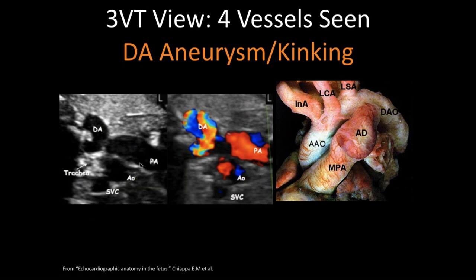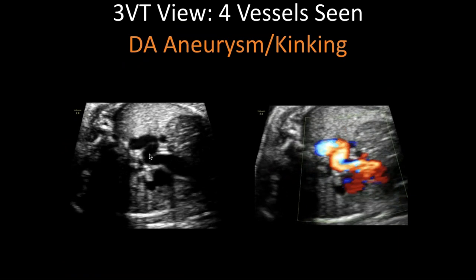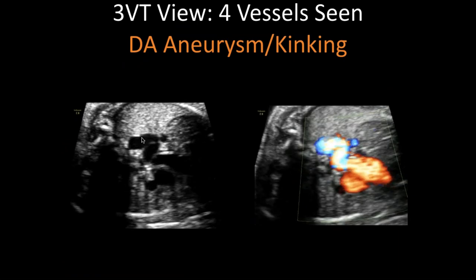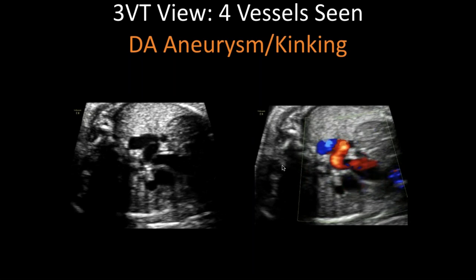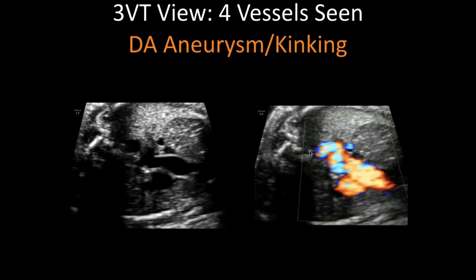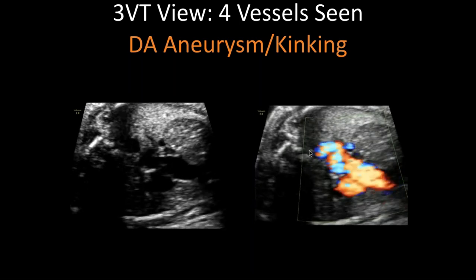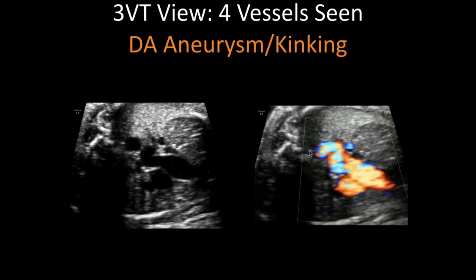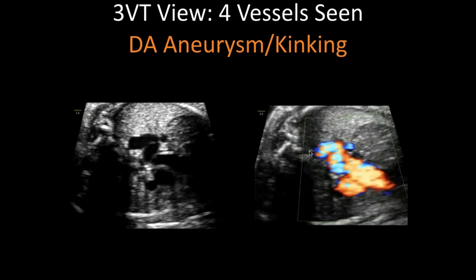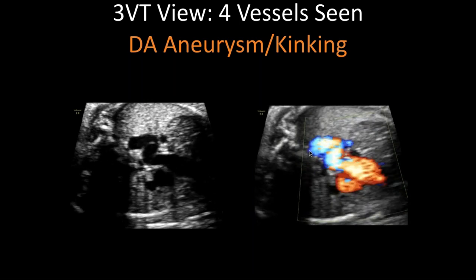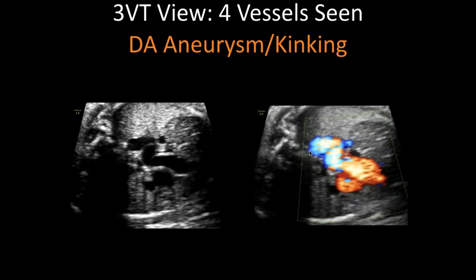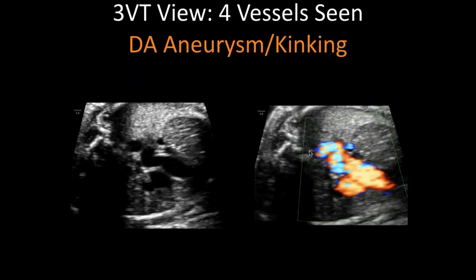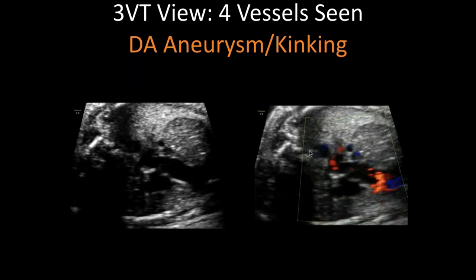On occasions, you see kinking in the ductus arteriosus — quite common especially in the third trimester — which looks like a fourth vessel. These are normal findings and not malformations; we call these normal variants. The ductus arteriosus curves all the way around before it connects with the descending aorta. Remember, the ductus arteriosus closes shortly after birth. Make sure you don't confuse ductus arteriosus aneurysm or kinking with a fourth vessel at the three-vessel trachea view.